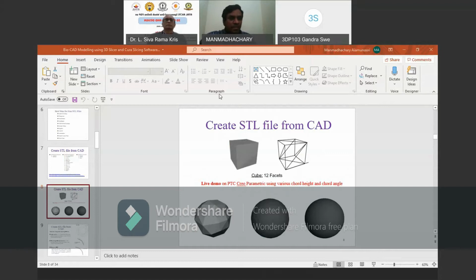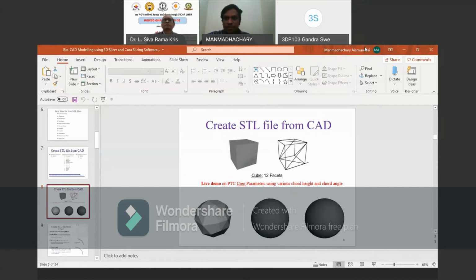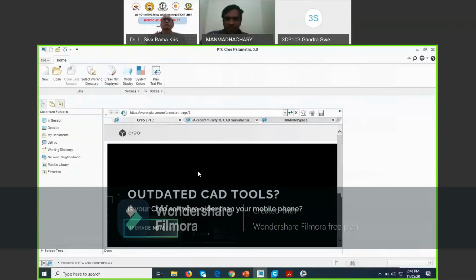Are you seeing my software window? We are able to see your PPT. You are able to see your PPT. Okay, I want to stop it. Now, sir? Now you are seeing my screen? We are able to see your software.